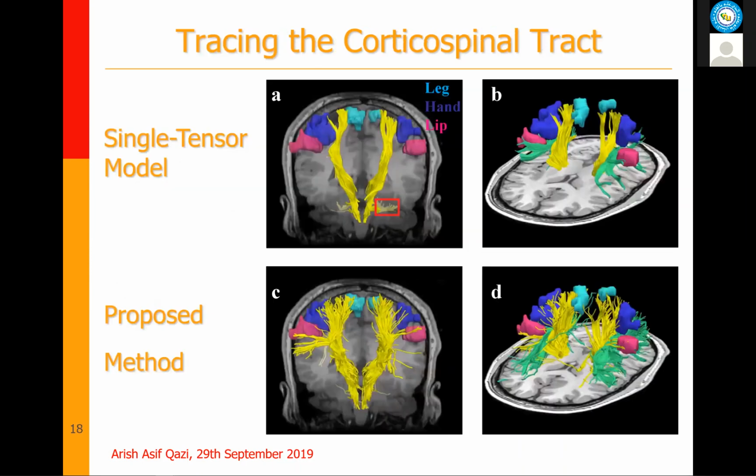Now, what we did was we developed a technique that can actually resolve fiber crossings. This is an image showing the standard technique, and this was the technique that was developed. And here you can see it can resolve all these tracks over here.